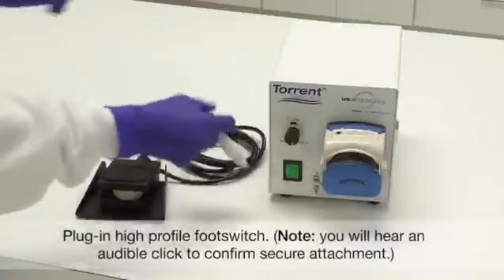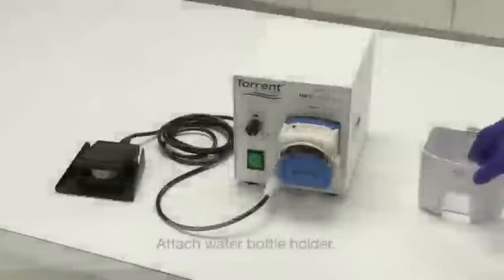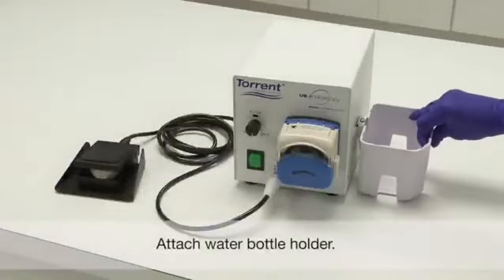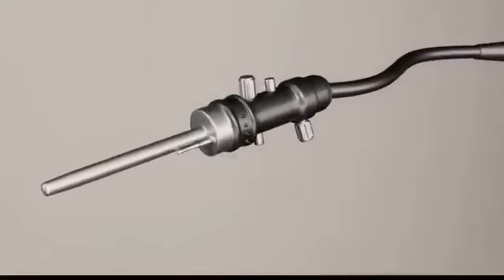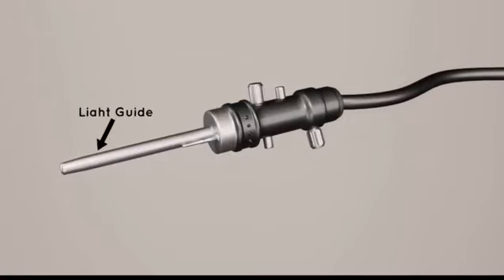Water container or irrigation bottle connector. The water container, cap, and tubing that are used for the insufflation of air and lens wash. The irrigation bottle refers to a water container and tubing and accessories that are used to flush water through the endoscope. Light guide. Flexible light guides make it possible to direct light from any chosen point, balancing any relative movement between the light source, the illuminated object, or the detector. Light guides consist of a single fiber or compact fiber bundles surrounded by a sheathing.